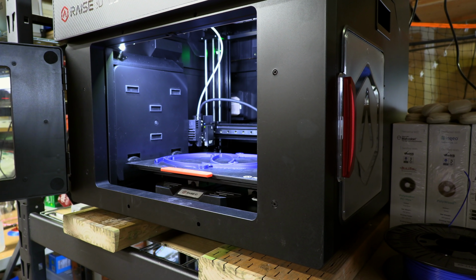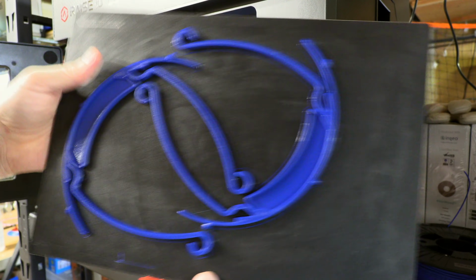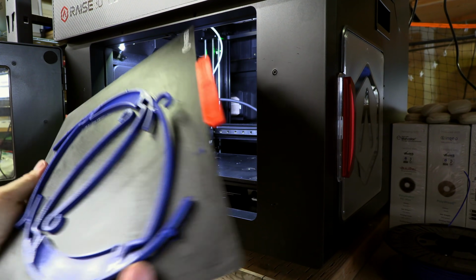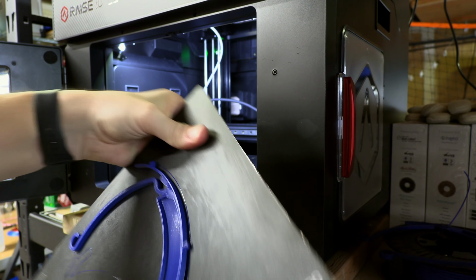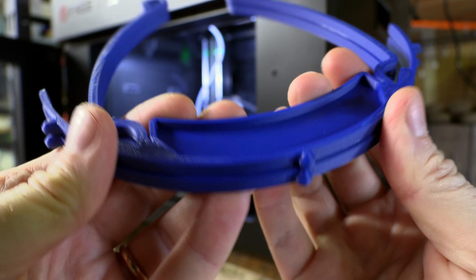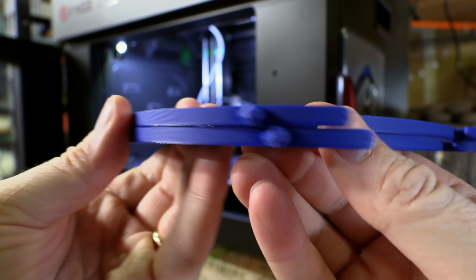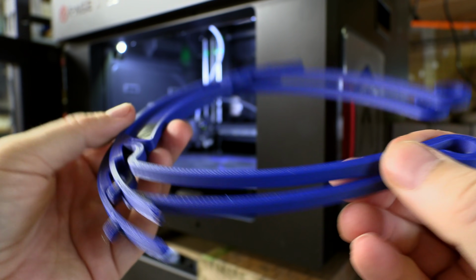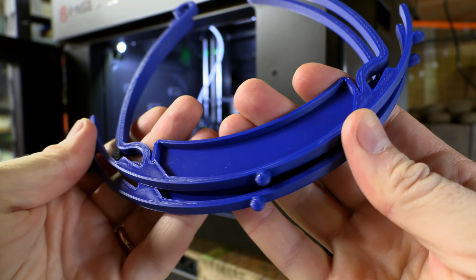Let's open this up and then take that out. Look at that. That's not too shabby. We gotta get these off the build plate. It is flexible. PETG loves to stick to this BuildTak like crazy amounts. Ugh, there we go. Got one off. Oh, there we go. Oh no. It's blue, so it's gonna be better. Again, this is Overture 3D PETG. Guys, gorgeous. The only issue with this was pulling it off that BuildTak, which, I mean, you run a bunch of these on there and it's gonna see some usage, but God, these look great. Okay, on to the next machine.